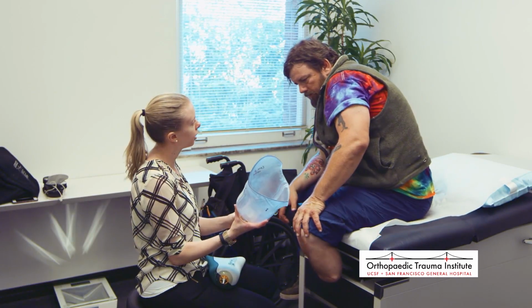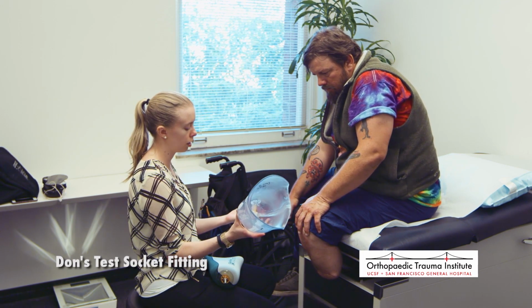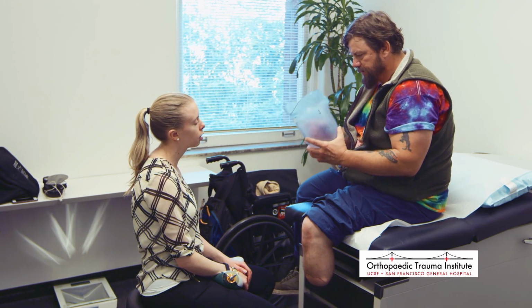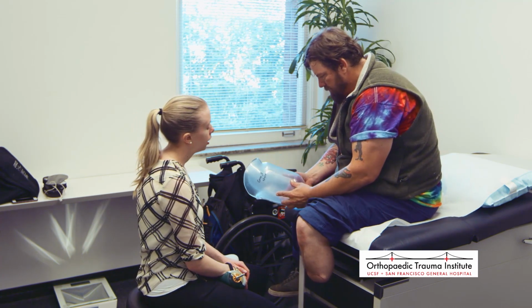Today, Mr. Case came in and we talked about what the plan was. Part of the process is setting expectations, and we talked about our goals for today. Our goals were to do our initial test socket fitting and to potentially walk, but I didn't guarantee it, because our test socket is the most important part of the prosthesis, and if that's uncomfortable, then we don't proceed until we have something comfortable. So today we talked about our goals.